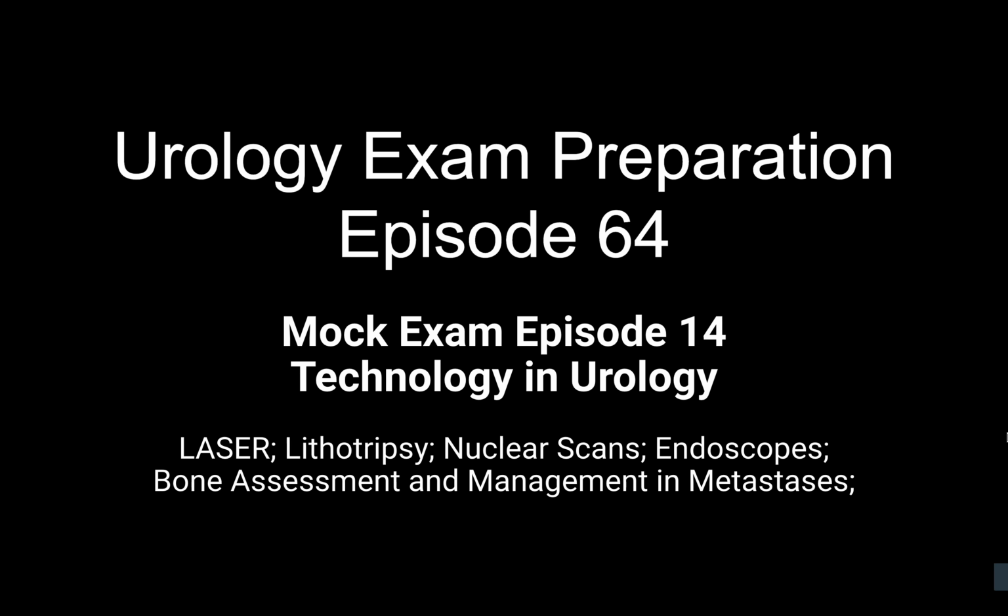Yes, indirect MAG3 renocystogram can be done, in which radioactive tracer is given intravenously without furosemide, and then the cystogram phase is taken, and then the dynamic images are taken when the patient is voiding. Why is it known as indirect MAG3?